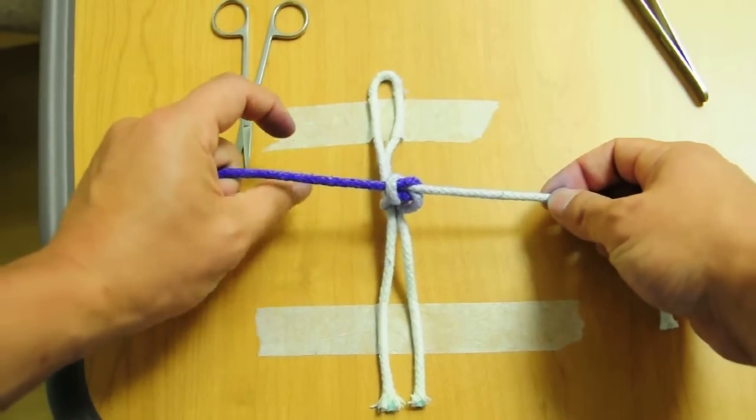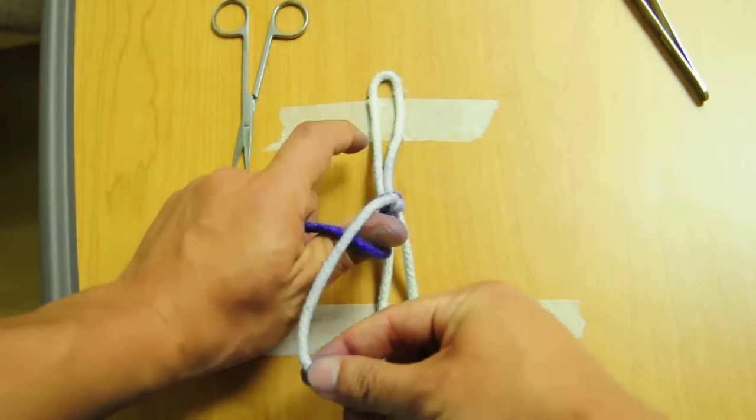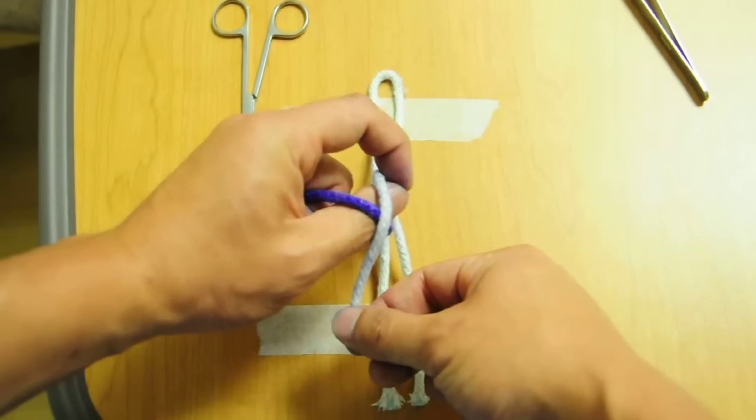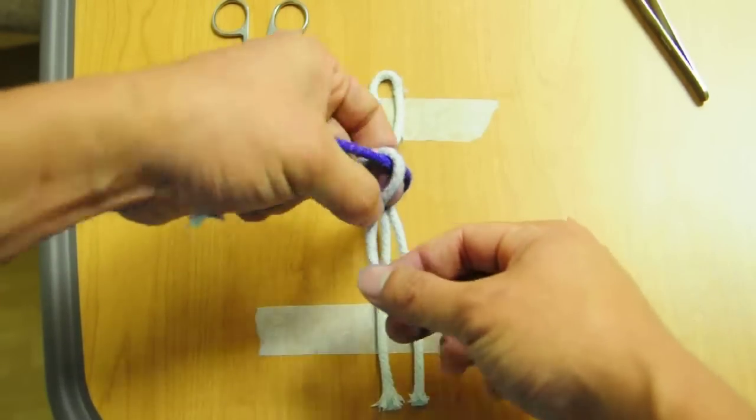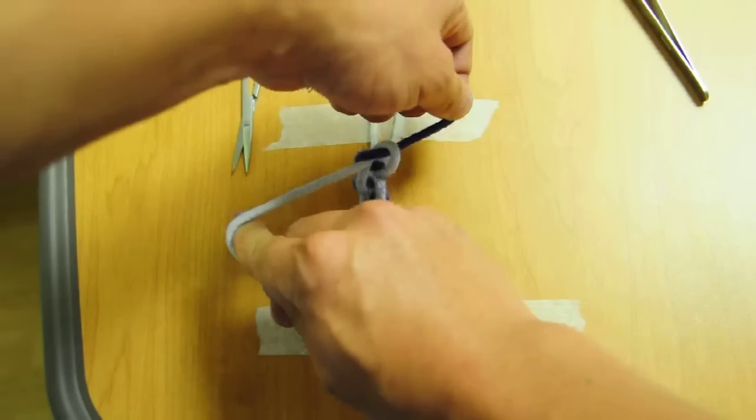Okay, one more time with the thumb throw. Your thumb's going to come under, going to make a circle, a loop, close it, a loop, come to the other side, grab it, push it through with your thumb, because we're on a thumb pass. Cross your hands to lay it nice and flat.